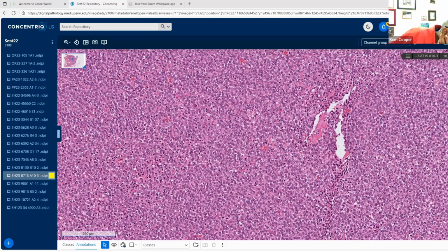Let's see if we can get in another tumor. I don't want to put in something that's too complex, and I'm trying to look for something that's fairly straightforward. All the cases that I choose and keep for these sets are just intriguing and unique and rare, and I enjoy putting them in here and enjoy talking to you. Let's give it a shot and let's see how it goes.